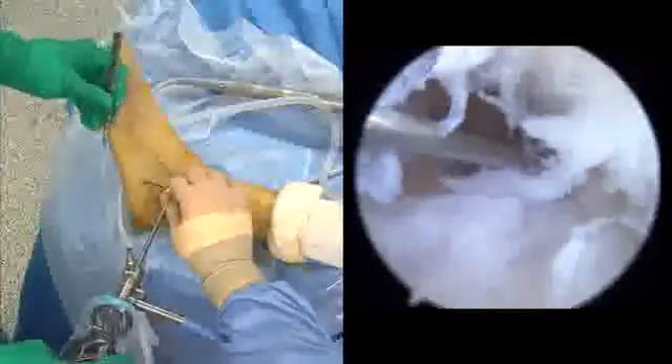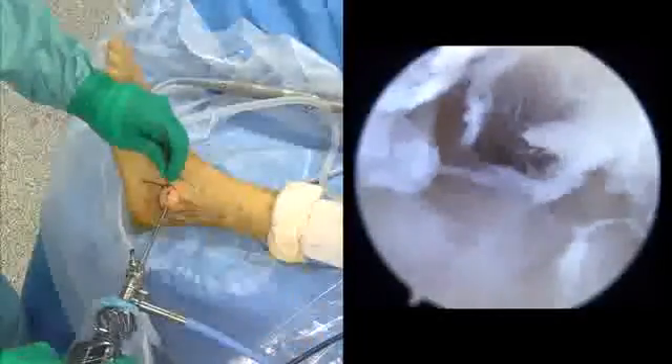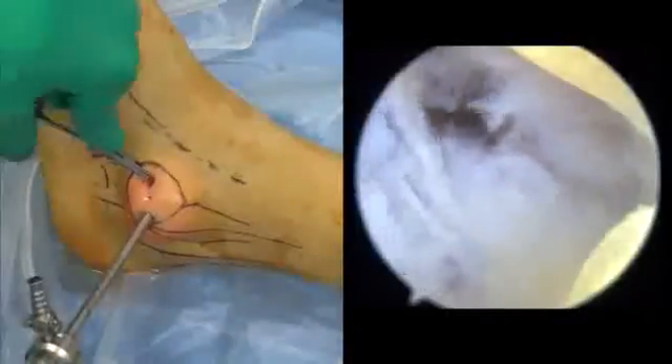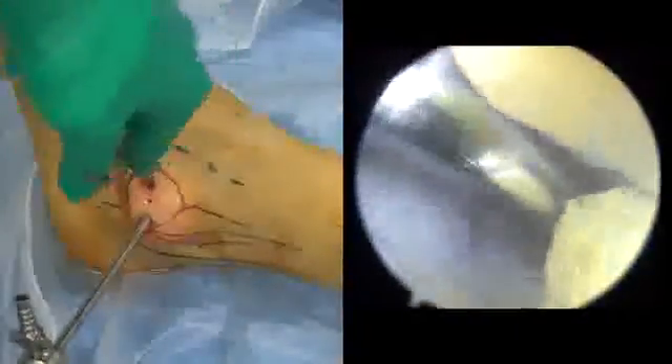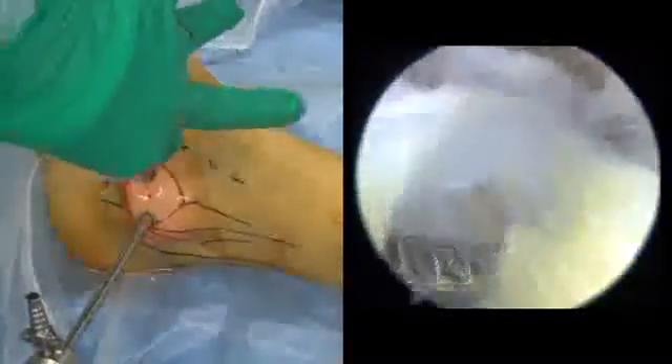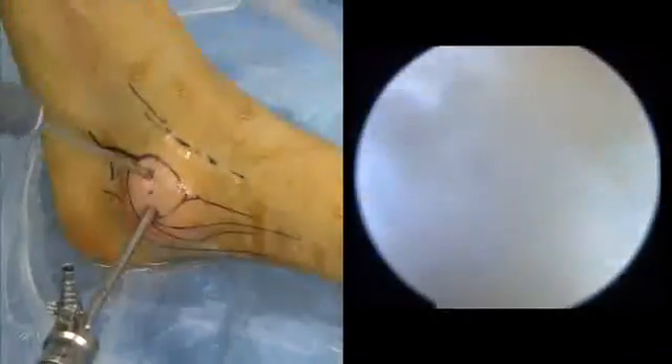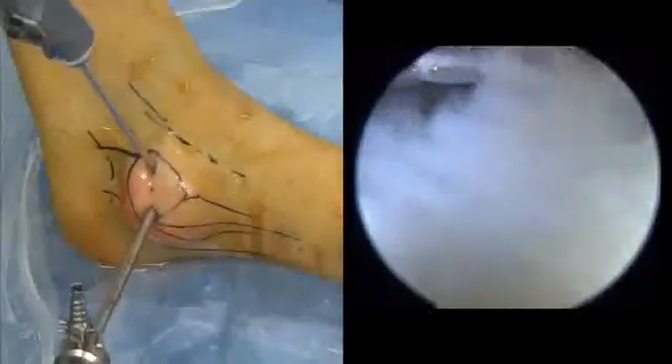The skin is incised for the anterior portal and then dissected with the mosquito clamp. A standard 3.5 full radius synovial resector is inserted in the anterior portal.